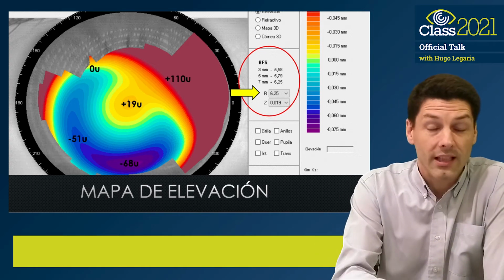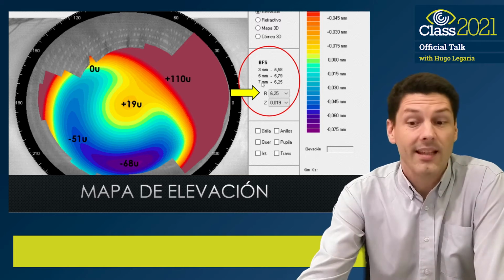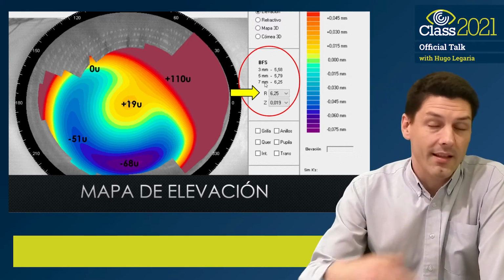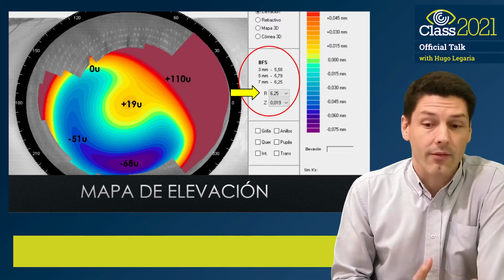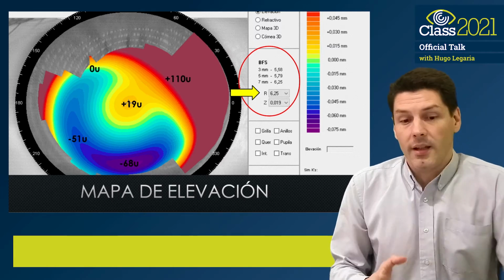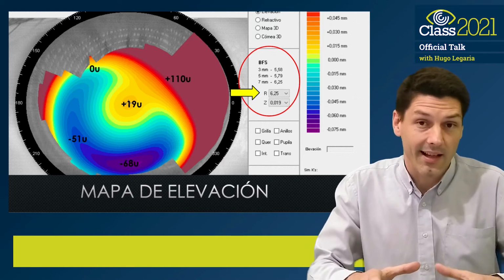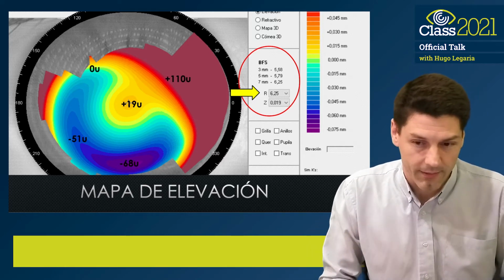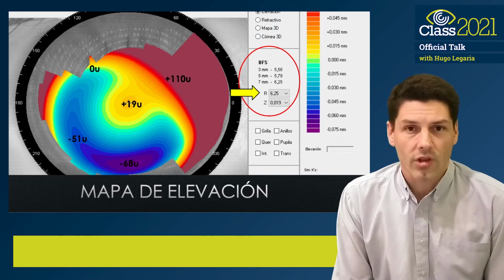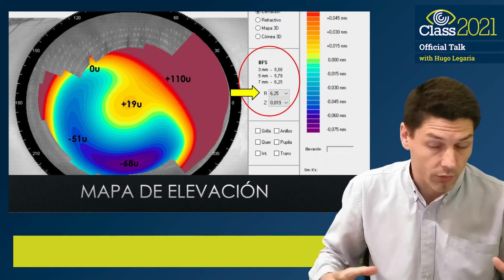And it is simulated based on the 7 millimeter reference sphere, and it is always convenient to work with the 7 or 8 millimeter reference sphere because, let's say, of the area where the lens that we are going to fit will land. It does not make much sense to work on 3 millimeters in diameter because the lens will land much farther out on the refractive map.